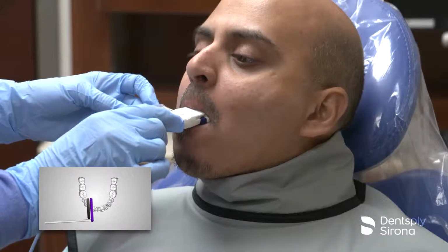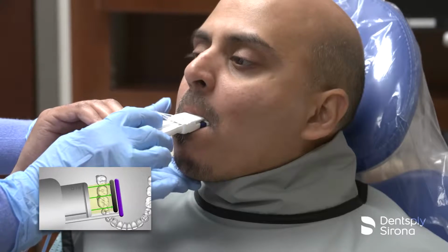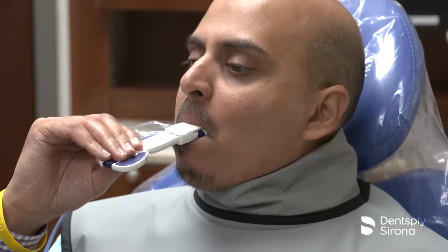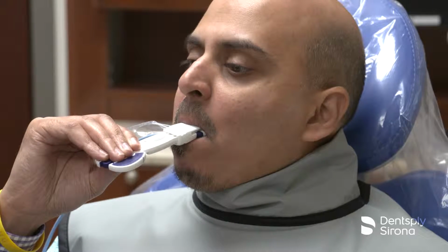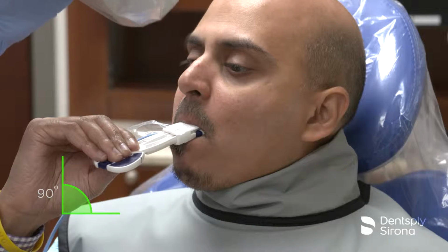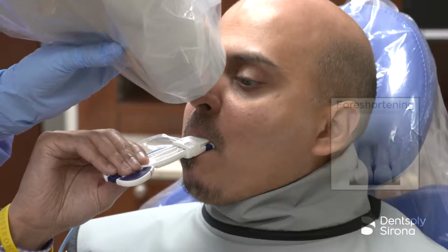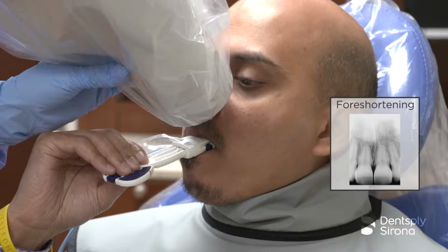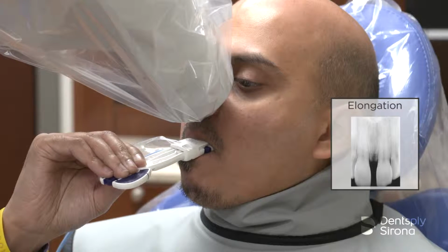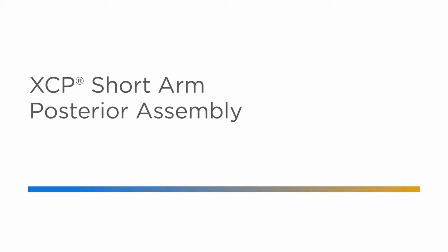Once again, the X-ray beam is directed to pass between the contacts of the teeth being radiographed in the horizontal dimension, just as it is in the paralleling technique. The vertical angle, however, must be directed at 90 degrees to the imaginary bisecting line. Too much vertical angulation will produce images that are too short or foreshortened, and too little vertical angulation will result in images that are too long or elongated. The beam must be centered to prevent cone cutting.